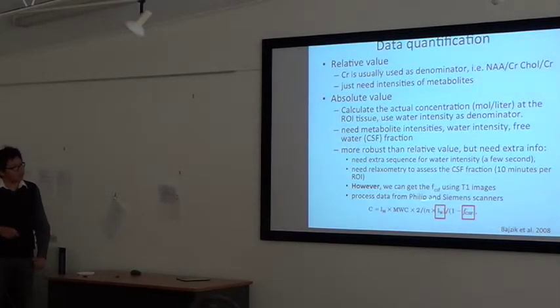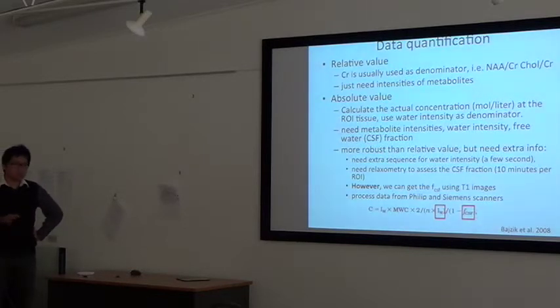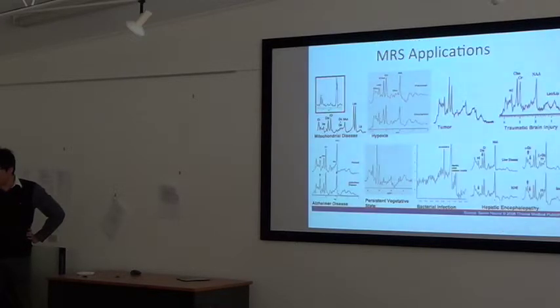So that is very important for all types of signal processing, for MRI spectroscopy processing. My script is now working with Philips and Siemens scanners, and the GE scanner is on the way. I'm happy to share the script with you if you want to process the data, and it's going to be public once everything is finished. Okay, so that's all about the technical part.